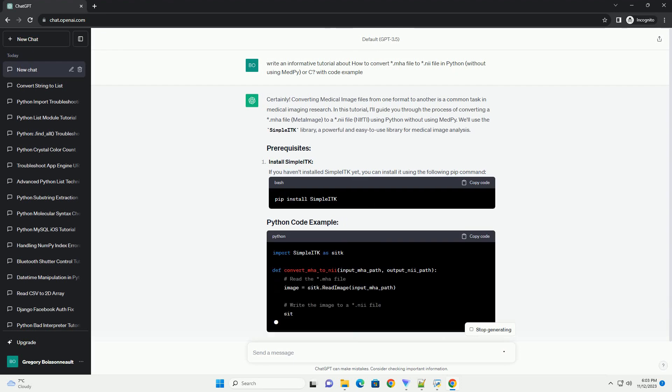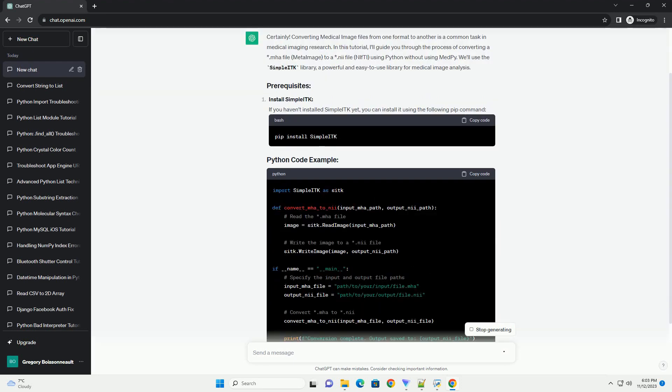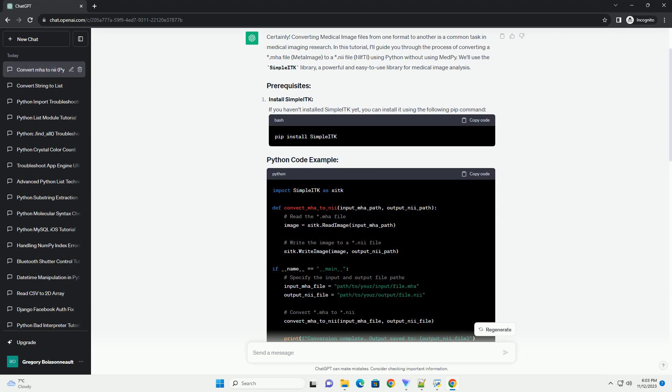In this tutorial, I'll guide you through the process of converting a .mha file (meta image) to a .nii file (NIfTI) using Python. We'll use the SimpleITK library, a powerful and easy-to-use library for medical image analysis.